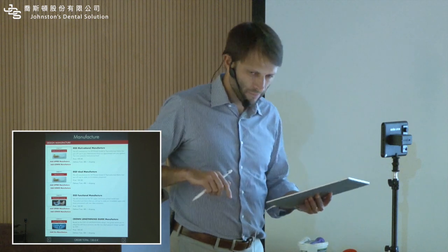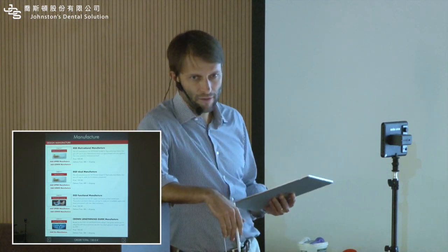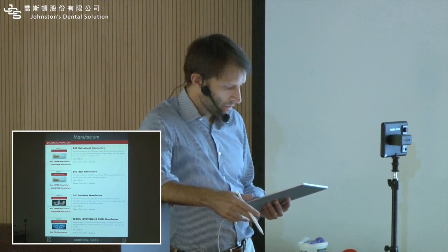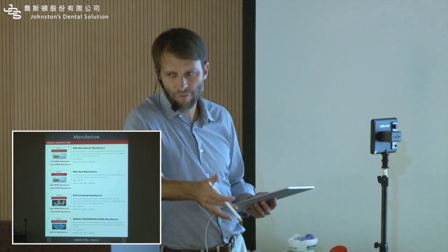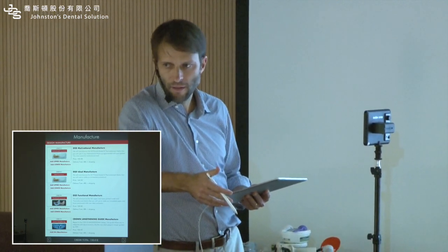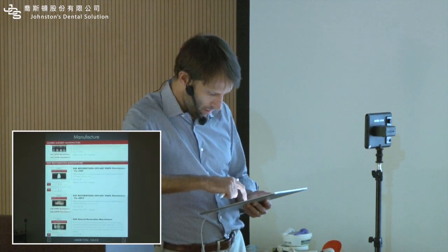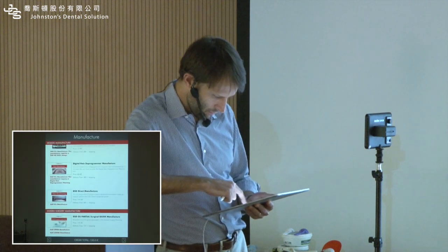This is important. This last page is asking, do you want just the file or you want us to manufacture? Okay? So if you click nothing here, you're going to get all the files and you're going to have to print. Okay? Either the model or the shell. Where's the shell?